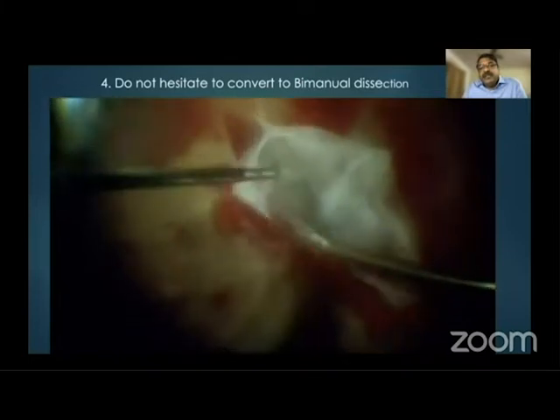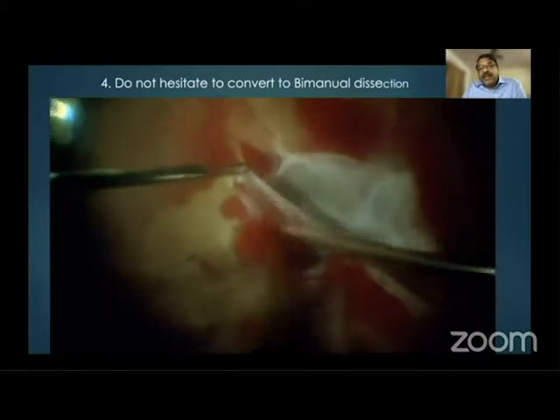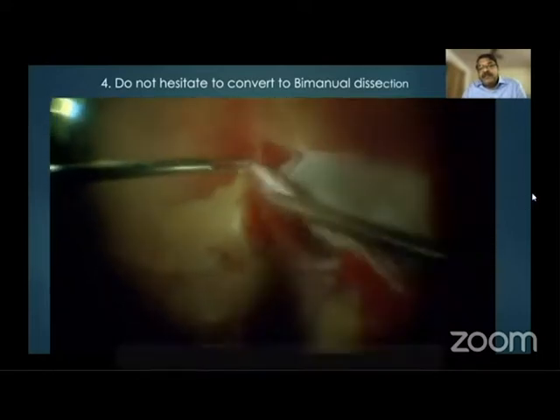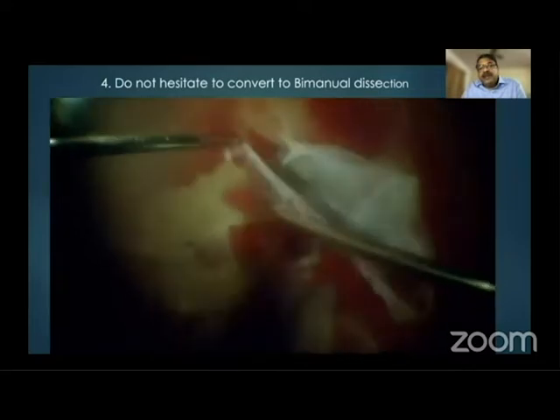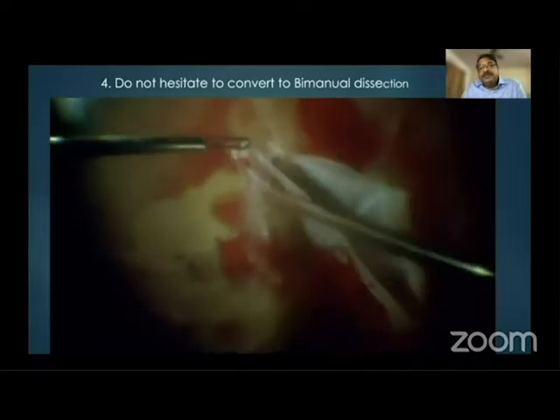And I use a scissors to dissect this membrane. You can also spare the larger blood vessels by doing this. And you can remove this membrane in total.